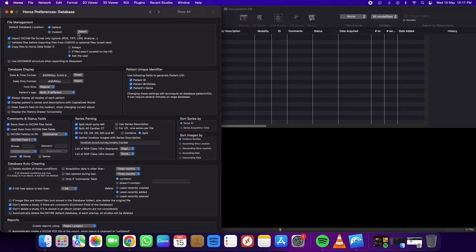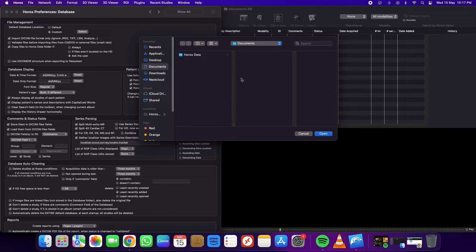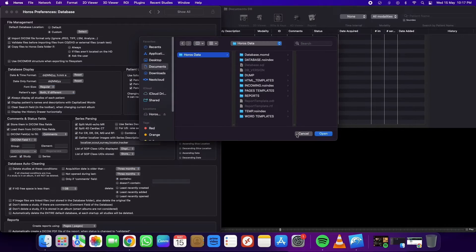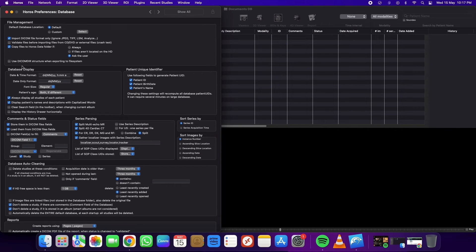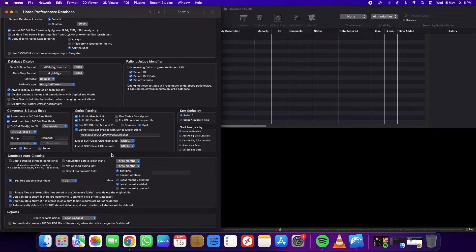In the database settings, you can choose the location of the database and the data fields displayed in the main window. You also have the option to auto-clean data based on your computer's disk size.